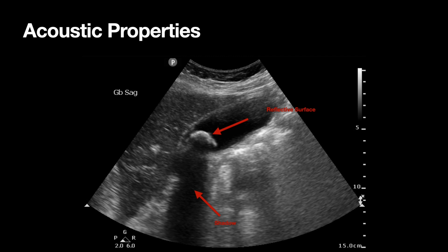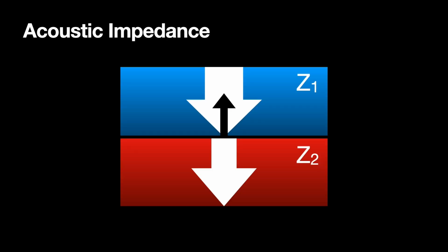So the question then is why, right? Why does this do this? I always like to not just understand what's going on, but the why, so that I can take that knowledge and apply that elsewhere, or understand the nuances a little bit better. And so this all comes as a result of an impedance mismatch. So we're going to dive into just a touch of physics here for the next minute or two.